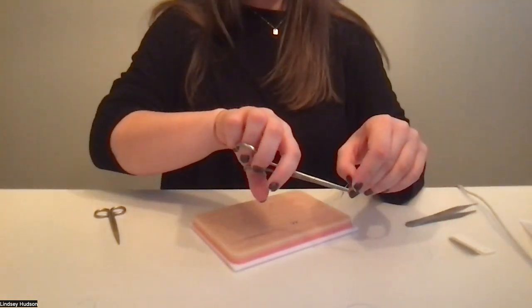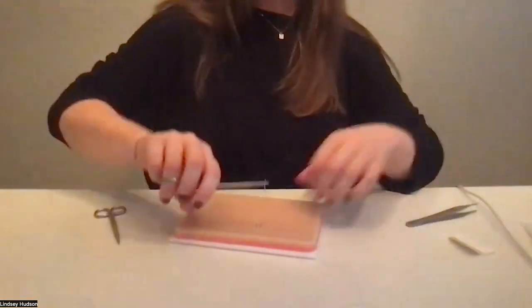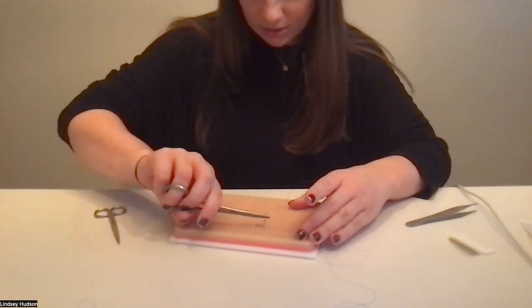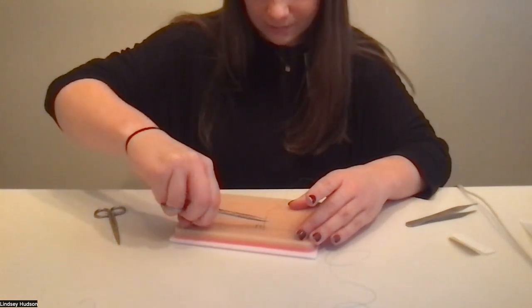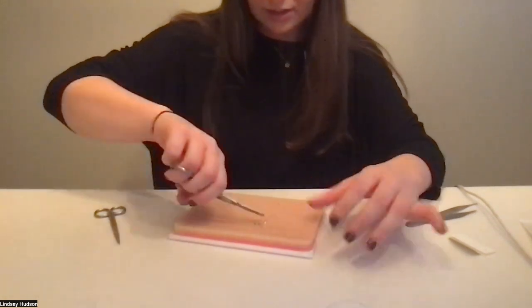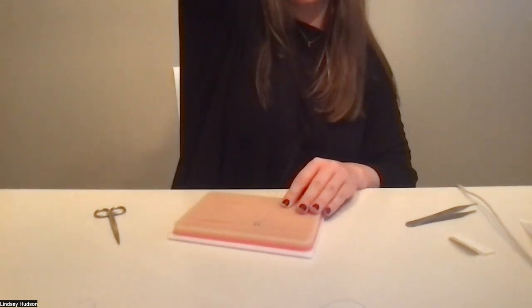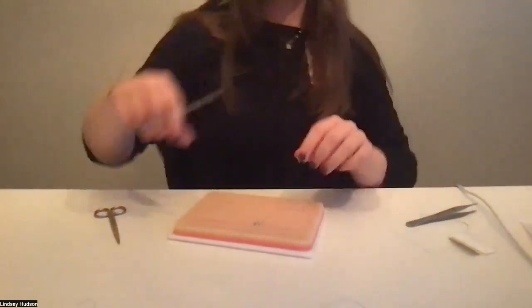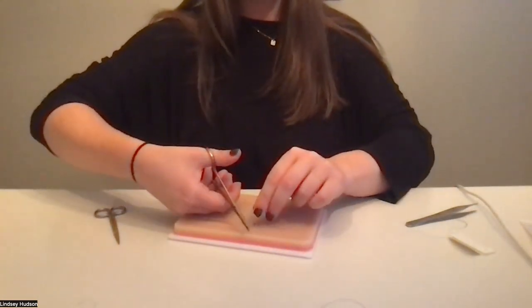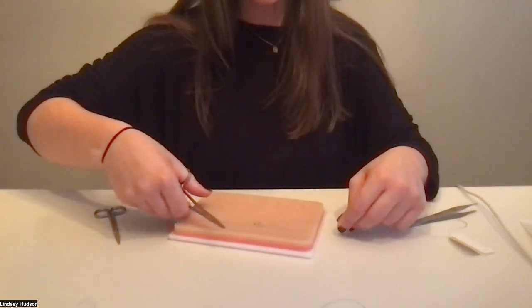So we're going to go in for our third suture. And again, about 10 millimeters or so away, down at a 90 degree angle. Twist the wrist to come through the other side. Pull through until you have about a 1.5 inch tail. And now we're going to create our surgeon's knot. Loop it twice. Grab your tail, pull it through and approximate the skin.